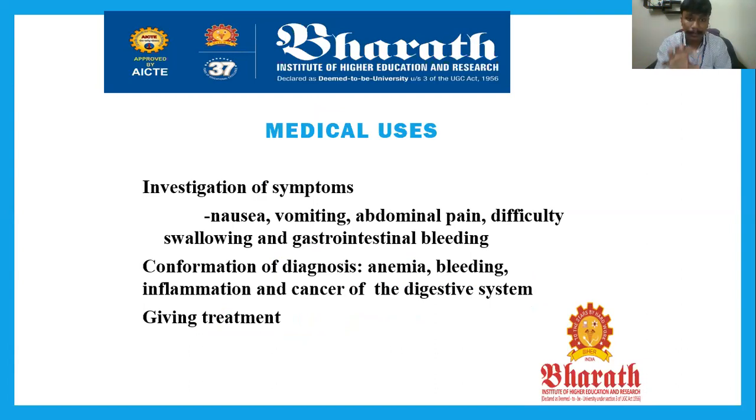These are the limitations faced by the patient while doing the endoscopy, but we have to overcome them, because surgery would be a bigger drawback for the patient. So we have to overcome this limitation and risk to perform endoscopy, an imaging methodology to view the internal organs.